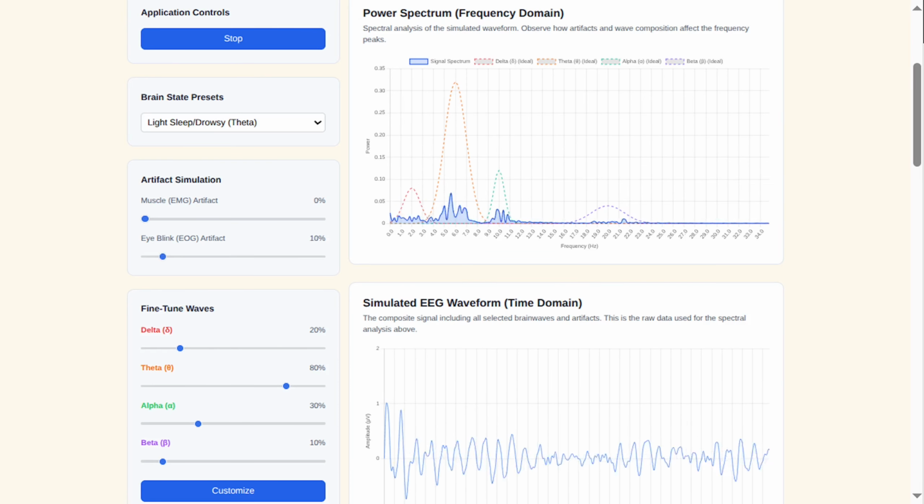Can you talk about the signal quality? EEG signal quality depends on factors like electrode placement, sensor type, and interference. High-quality recordings use medical-grade electrodes and good contact with the scalp to reduce noise and improve signal clarity. Okay, and how else could you improve the signal-to-noise ratio? Improving the signal-to-noise ratio can be done by using high-quality amplifiers, reducing muscle and environmental noise, and applying filtering techniques. Proper skin preparation and the use of active electrodes can also further enhance the clarity of the EEG signal.